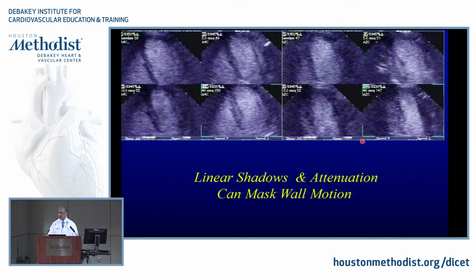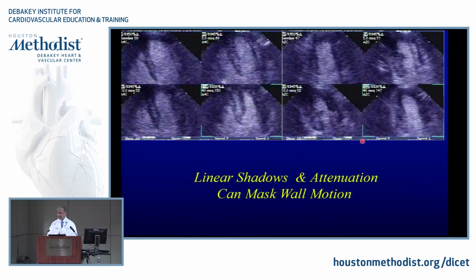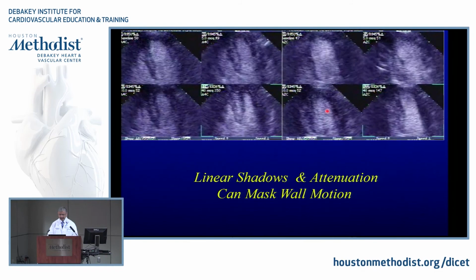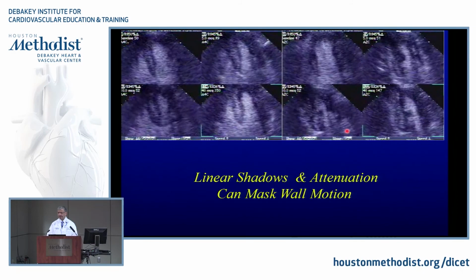Now, you wanna make sure also that you're not fooled. So you can be fooled either way. One, if the images are good, don't use contrast. If they're really good, don't use contrast. You're gonna have some attenuation, some issues. If the images are not good, I would use it, but with a caveat, make sure that you understand what you're dealing with. Meaning that in this patient here, believe it or not, there is a wall motion abnormality hiding right here. And your eye is fooled by thinking that this black linear density is actually where the endocardium is.